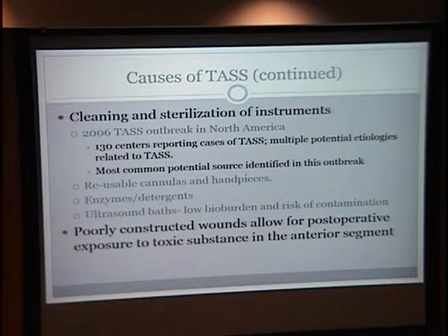One of the other major causes of TASS that was noted to be one of the most common causes during a 2006 TASS outbreak in North America was the cleaning and sterilization of instruments. This includes reusable cannulas and handpieces, and also talks about the enzymes and detergents and ultrasound baths. Like I mentioned earlier, these lumens of these handpieces may have retained cortical material or dried OVD that is not removed sufficiently through the sterilization process. These persist and allow for further contamination in subsequent surgeries.